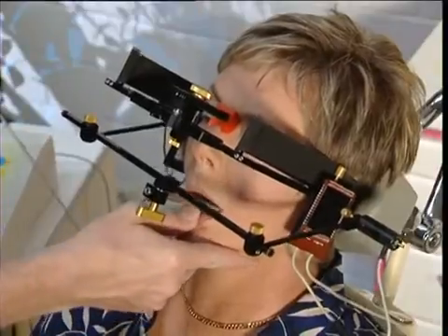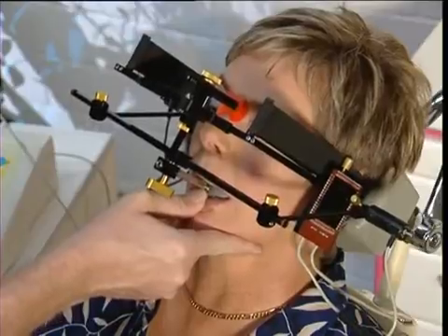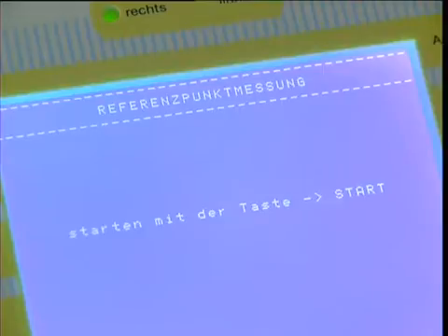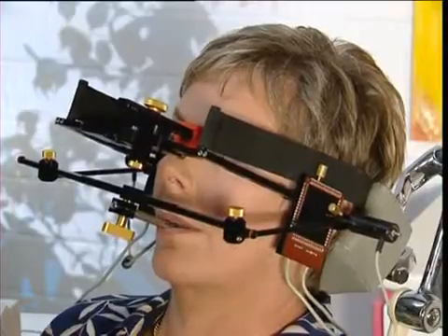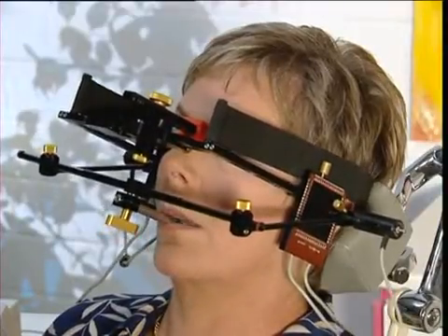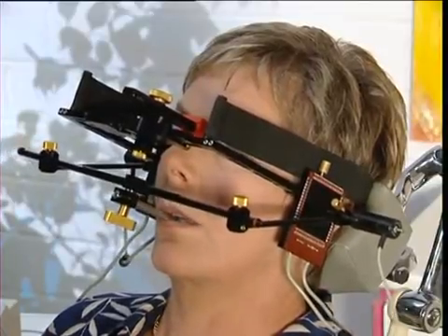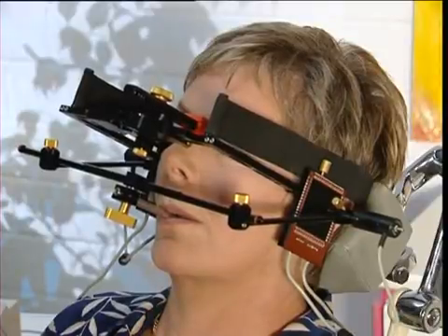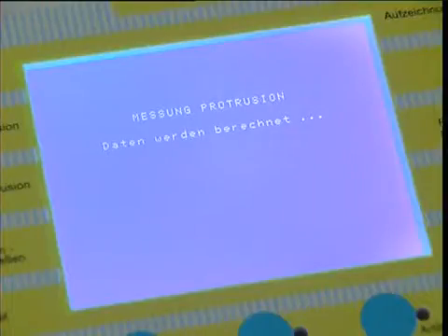The patient's mandible is guided to the reference point, if necessary, helped by asking to smile and close. The position is then stored with a foot switch. The protrusion LED flashes. The patient should be allowed to practice the protrusive excursion by pushing the mandible as far forward as possible, without the teeth touching the tray, and returning it to the reference point. Operating the foot switch records the repeated excursions between the 2 acoustic signals within 4.5 seconds.